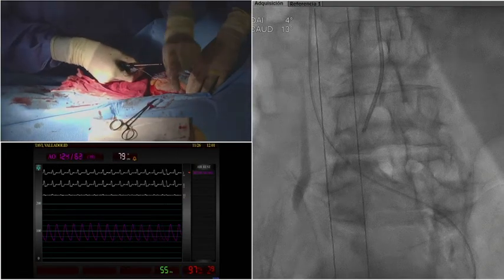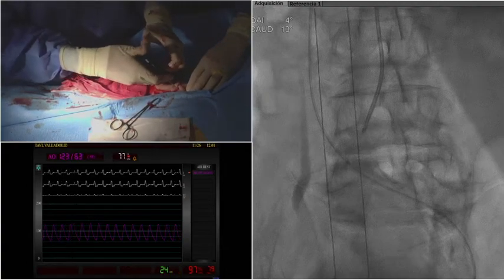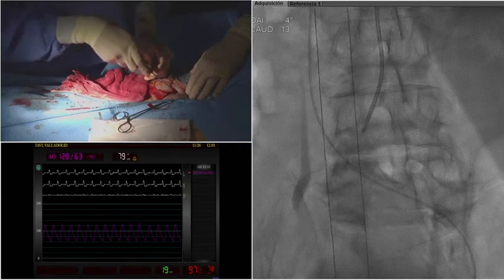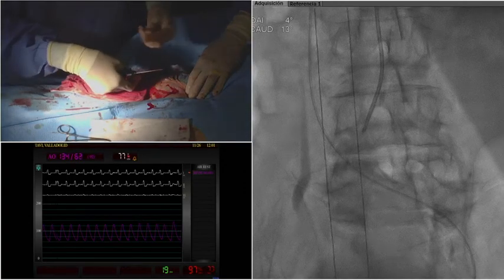So in these cases, we have checked the last ACT was 244, but there is no bleeding at all. So I wonder if you reverse the heparin in these cases or not. Half dose is reversed.